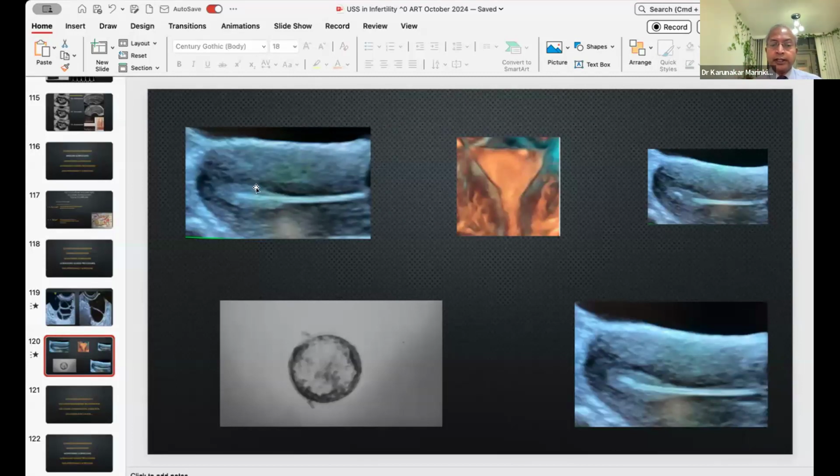As you can see, I take a lot of meticulous interest to see where the plane of the ultrasound is, where the plane of the catheter is, and then align that, go in ultra slow motion, and eject it. So this is a long video. As you can see, you empty the bubble, because we put a bubble in the front, a bubble in the back, and liquid in the center, which has the embryo. Then you expel the bubbles so that you are sure. It is an after-loading or fluid loading technique that I use for embryo transfer, not just squeezing the syringe and holding at the end with a lot of pressure. That creates vibration. It can suck the embryos back.